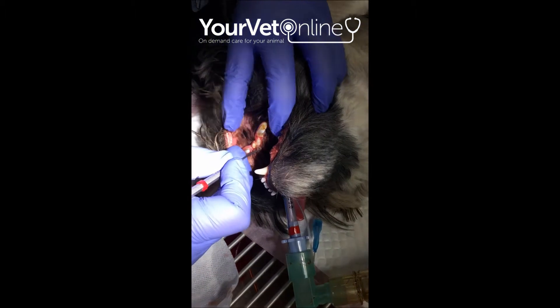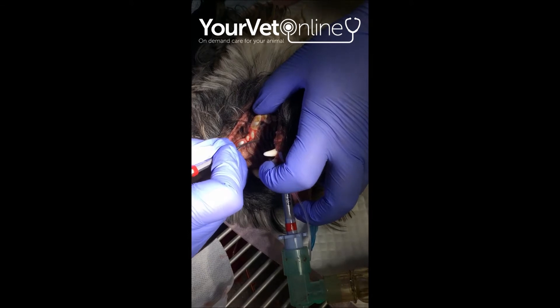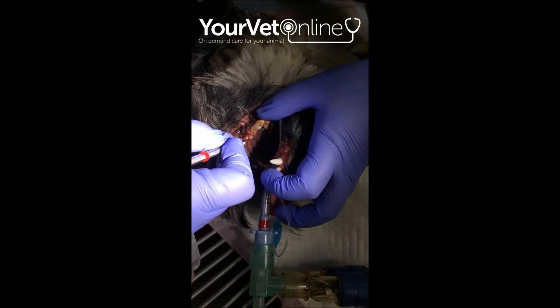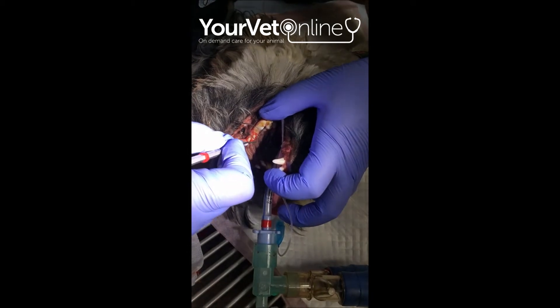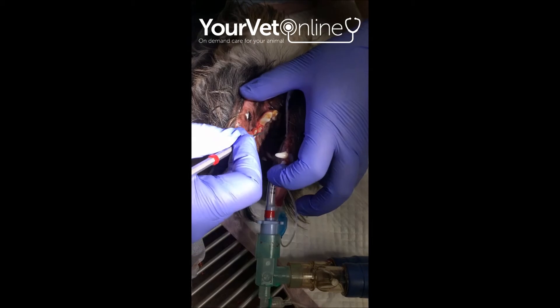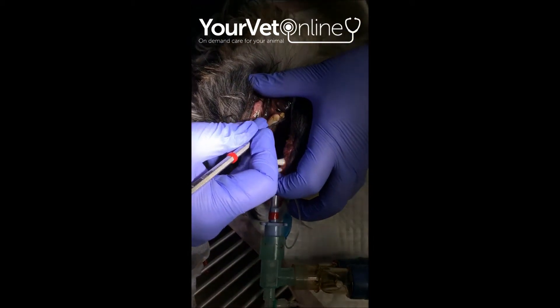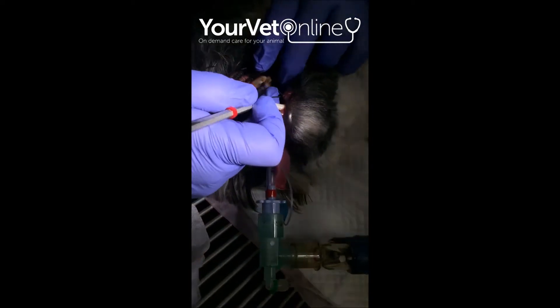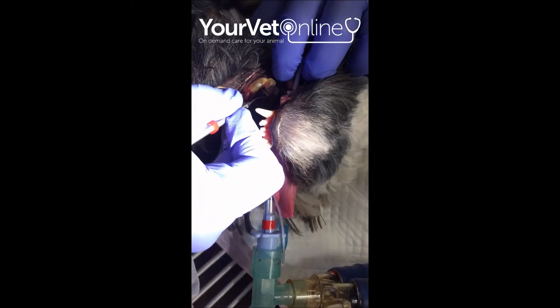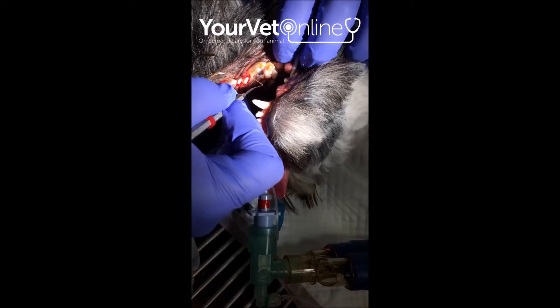Just note how every single margin of each and every single tooth is being examined, and also how hard it is to actually reach and examine those caudal back molar teeth — those ones that we see at the very back of the mouth. Even though this is a blunt probe, this process would be absolutely impossible in a dog without the benefit of anaesthesia.